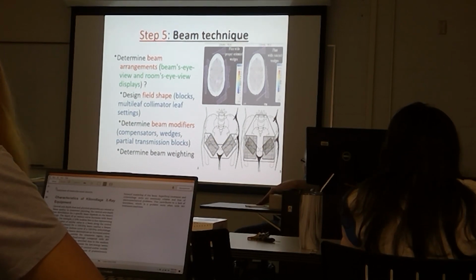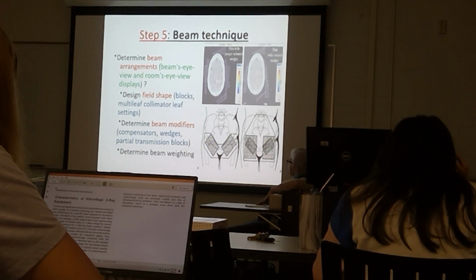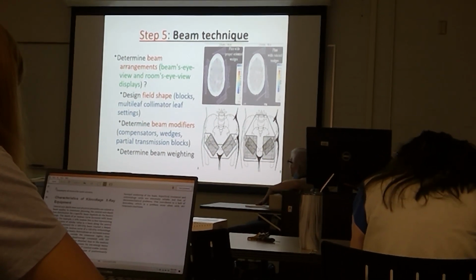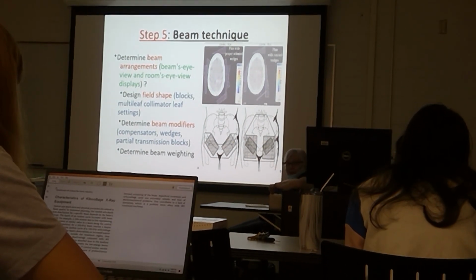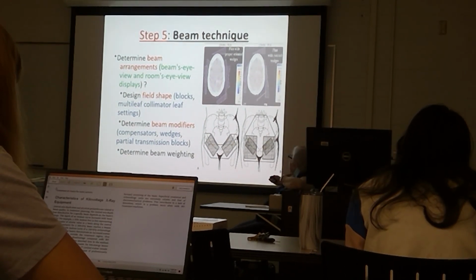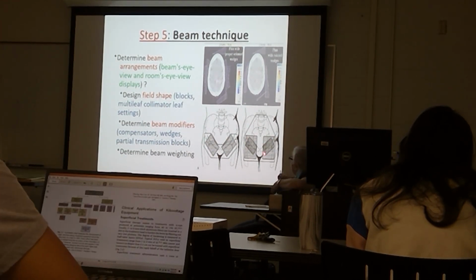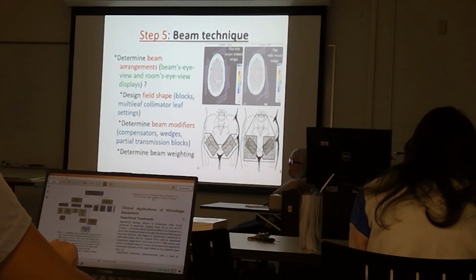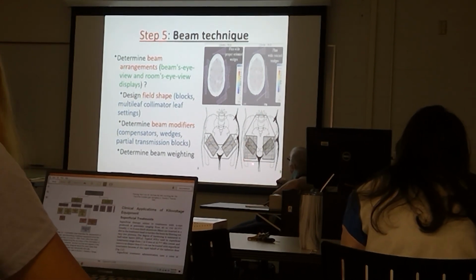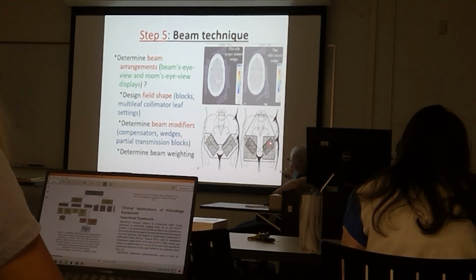So what do you think we are treating here? I'm going to take a guess anyway, but you guys can take a guess too. What do you think we're treating here? Ignore this one, this is one that I'm looking at. Inverted Y, so lymphoma. No, it's not an inverted Y. This is one large field, then you've got another field here, another field here, another field here, and another field here.